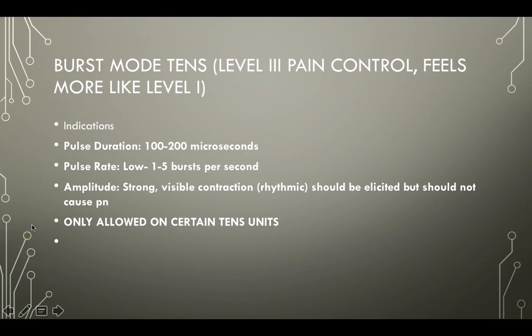Okay, so now is your time. You have one little quiz that you have to do, and that lets me know that you know your parameters for these different TENS units or TENS waveforms, and then you get to now learn how to set all these up on our various machines.